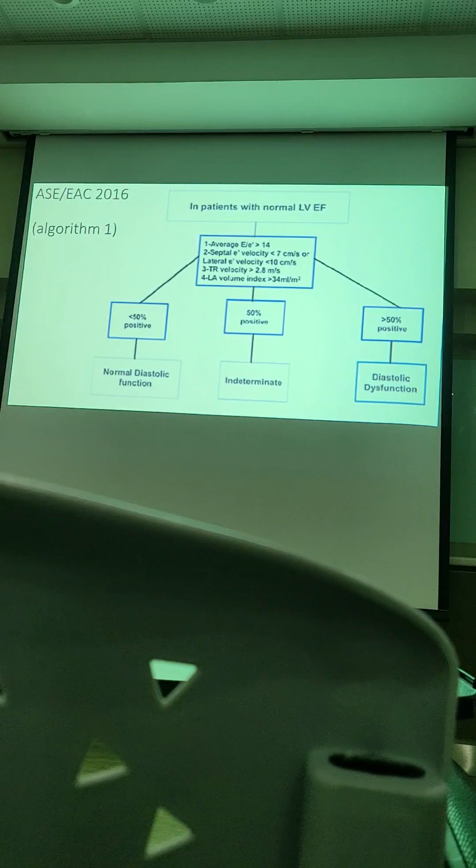Referring to the ASE guideline 2016, there are two algorithms. The first algorithm is for a normal myocardium, whereas the second algorithm is used when the myocardium is diseased.